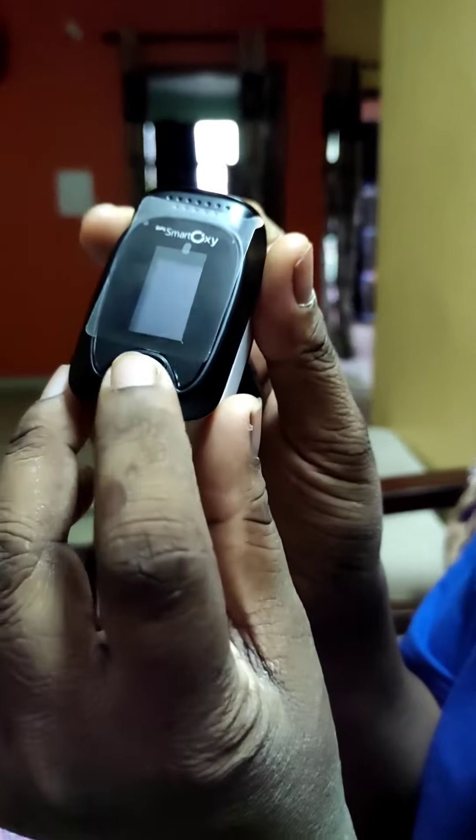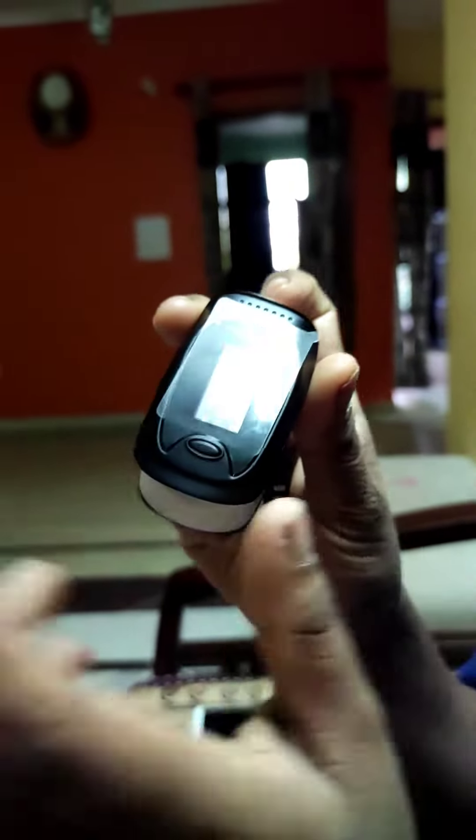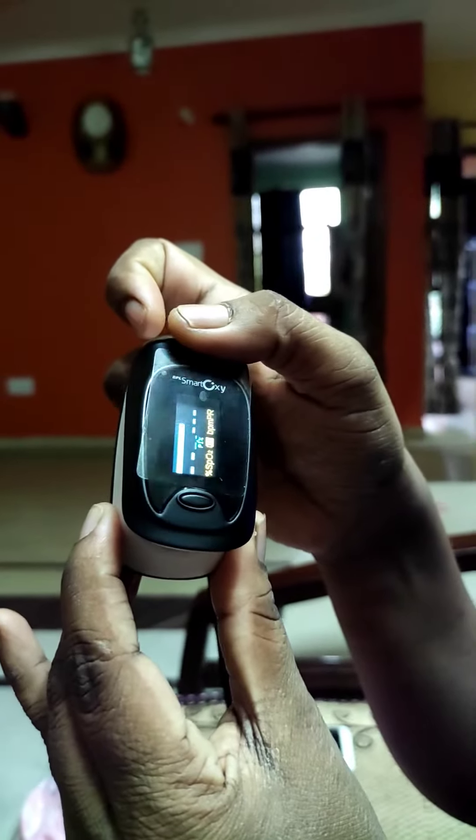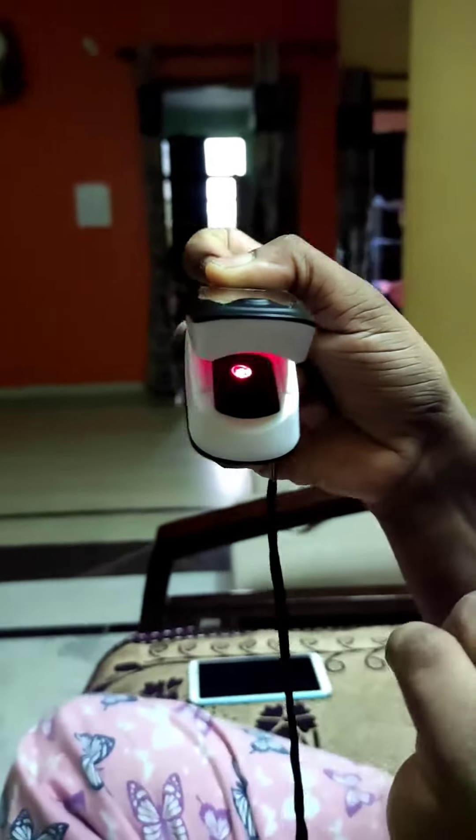I will tell you how to use this machine. This is a pulse oximeter. There is a button here. You have to switch on the button — press it only once. On the opposite side, press it and open the machine, and you can see a red light inside.